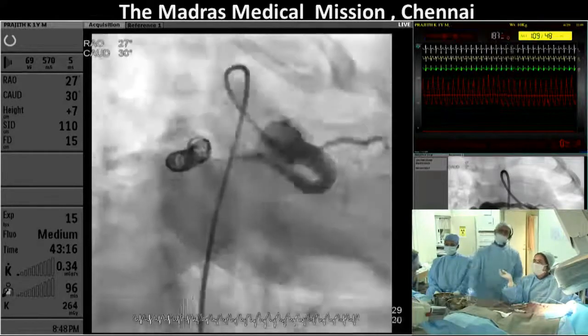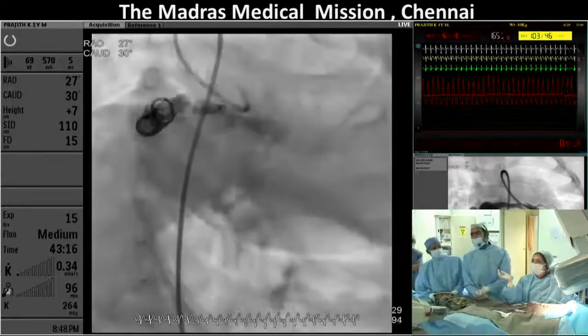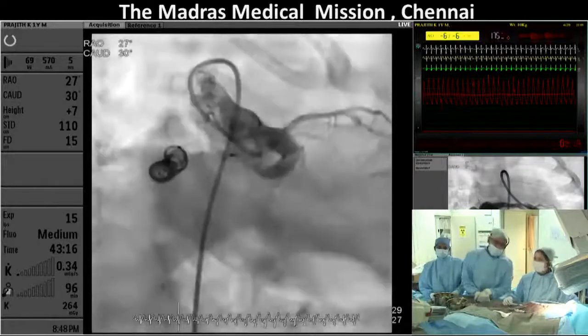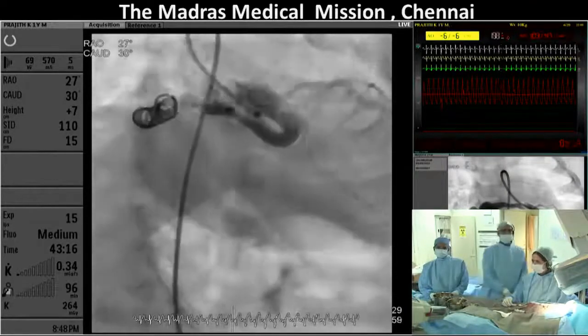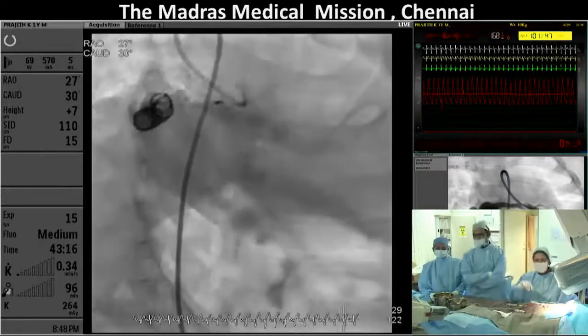I think the child has received a lot of contrast. Yeah. I think so. I will let you know next year what is the sinus nodal status of this child by possibly doing a Holter. Yeah, sure.